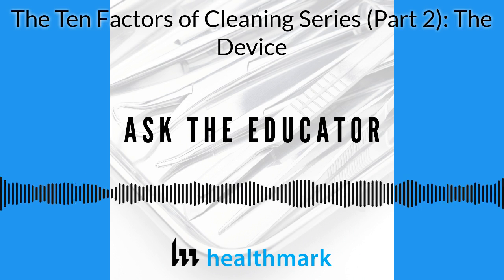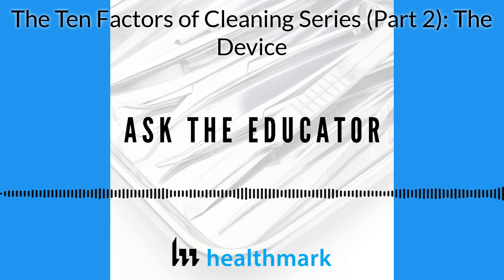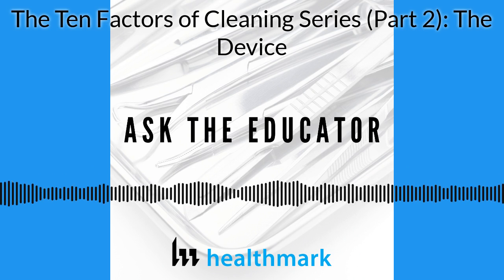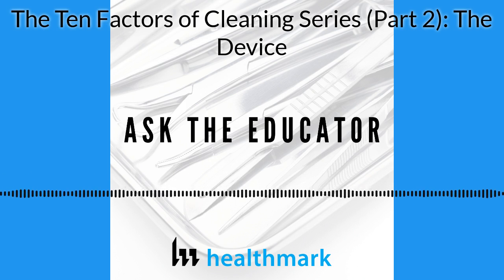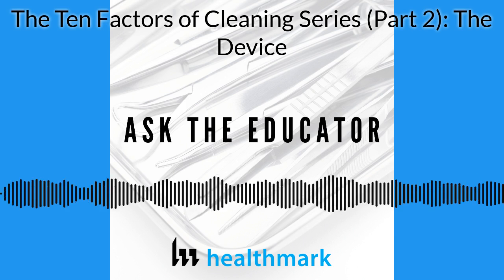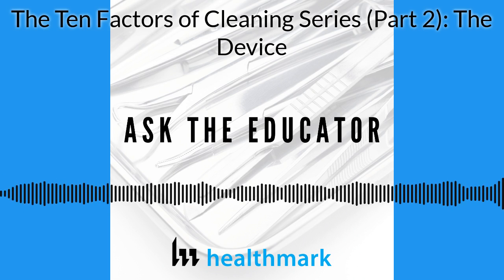So again, people need to understand the design of the device, and there's mixed metals now, how they interact with each other in a tray. So that design is very important. And to the people designing instruments out there, Kevin, I've heard you speak and everybody else, they focused on the physicians, mostly how does it look and feel.